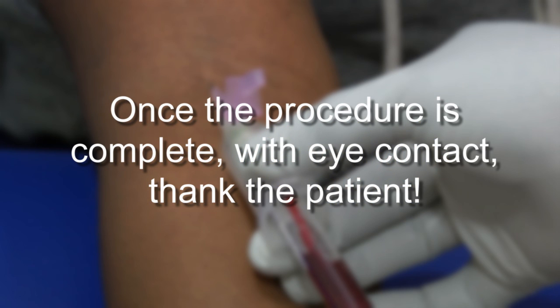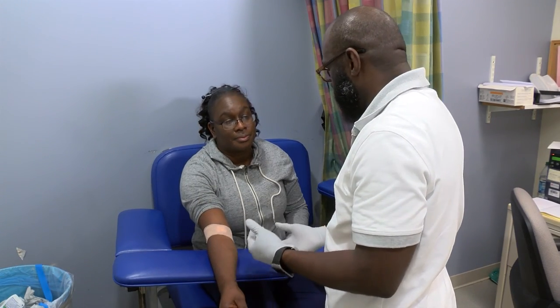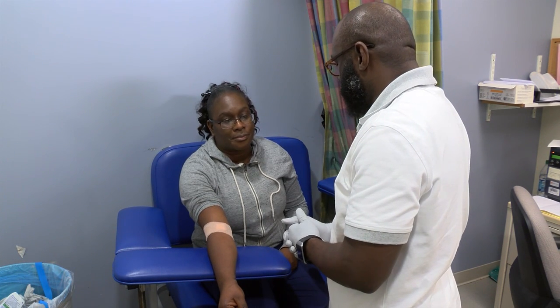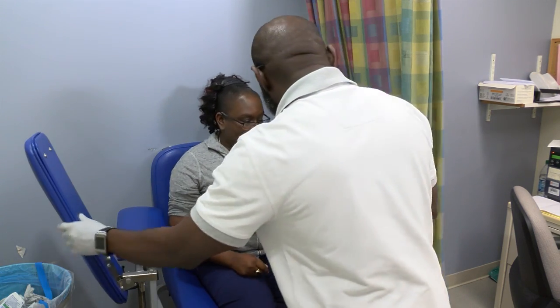Thank the patient. Once the phlebotomy procedure is complete, with eye contact, thank the patient. No pain. If you do feel pain, you can always put some ice to it. If it gets worse, you can always call your doctor or come to the emergency room. We'll take care of it, okay? Thank you. All right, and you're all set. Thank you. Have a wonderful day.